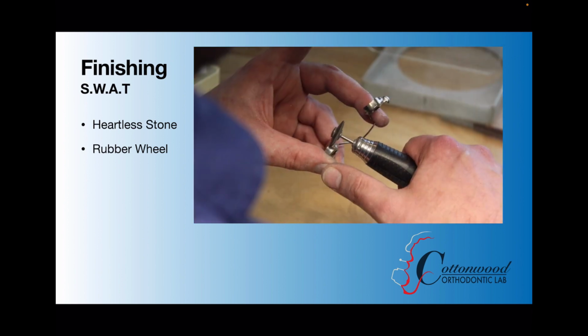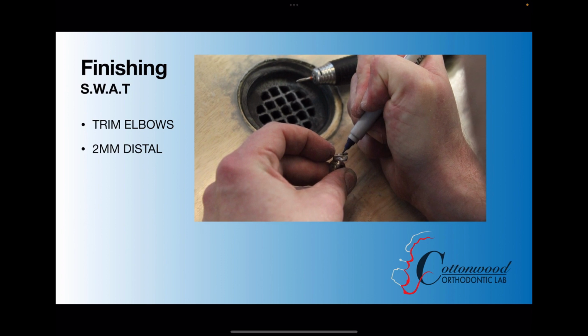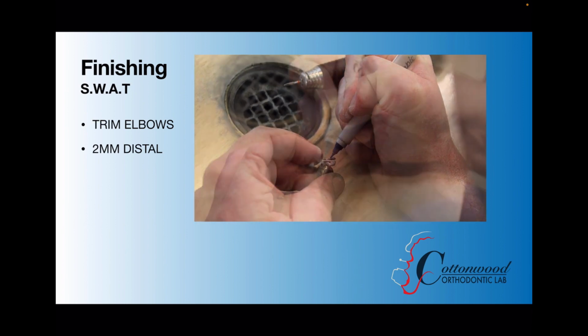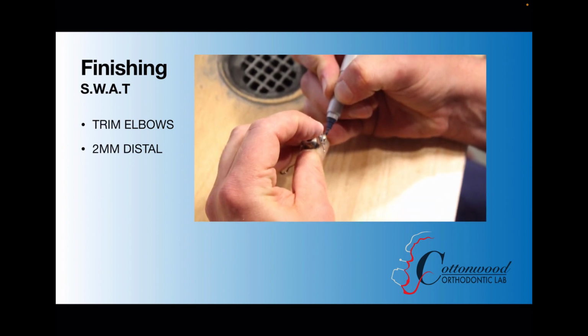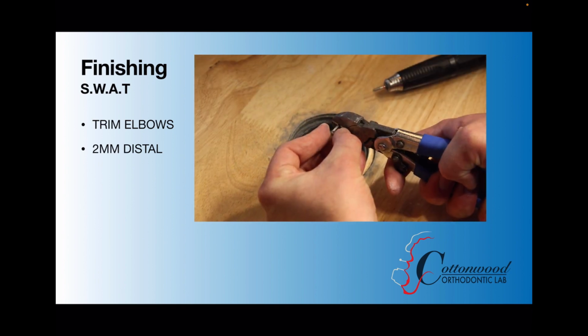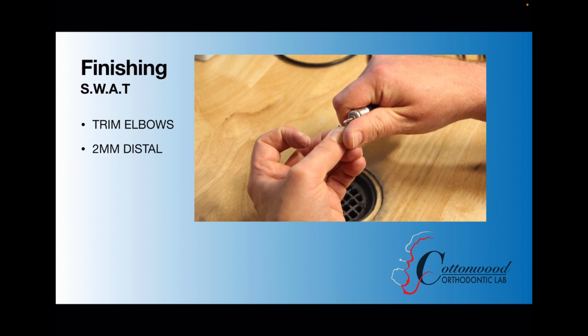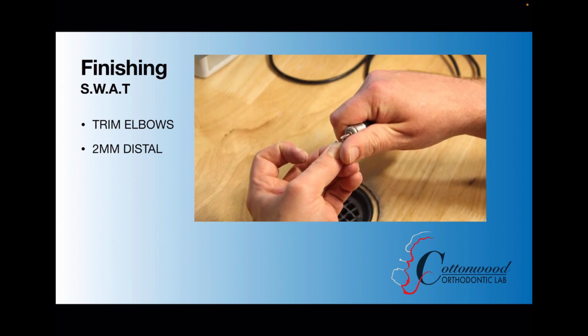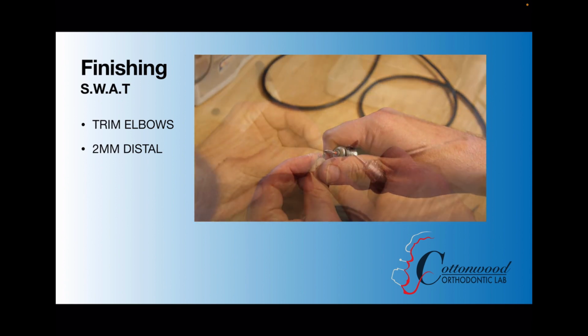Next, we're going to work on cutting up the tubes. So we're going to put the elbows in with the 2mm shims, and then we're going to measure about 2 millimeters to the distal of that tube. So you want about 2 millimeters of that elbow sticking out of the distal of that tube. Mark that with your Sharpie marker, and then you can just use a set of cutters to cut that short and then just smooth out the end. There we're using a carbide burr. You can use a heatless stone and then just finish it up with a red wheel to remove any burrs. That also helps with a smoother insertion of the appliance.